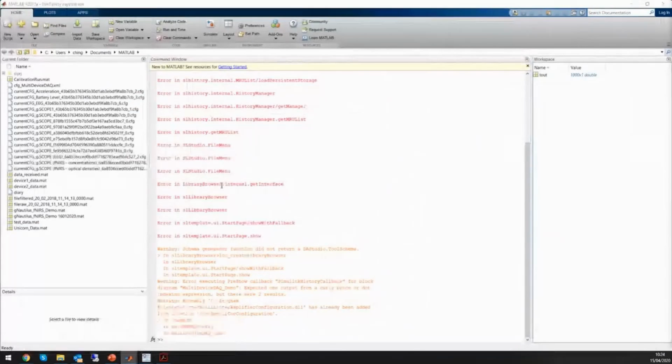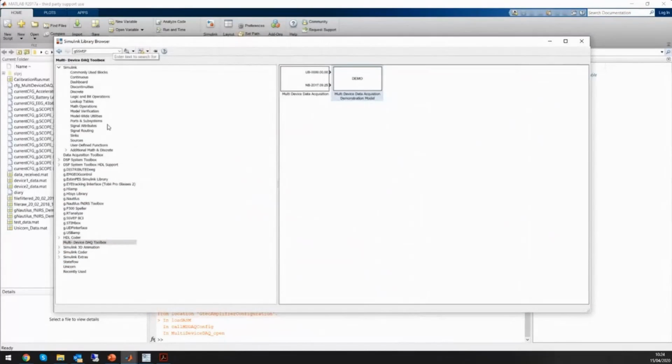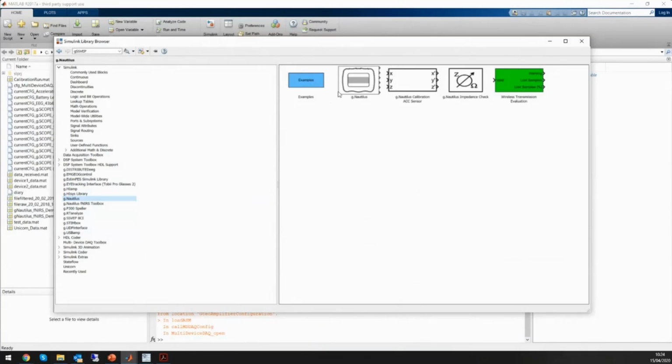After opening MATLAB, you can search all the functions through the Simulink library. For my particular computer, you can see I've installed quite a list of libraries for g.tec. Some examples would be today's g.Nautilus. You can easily configure the example by wiring the two boxes together.